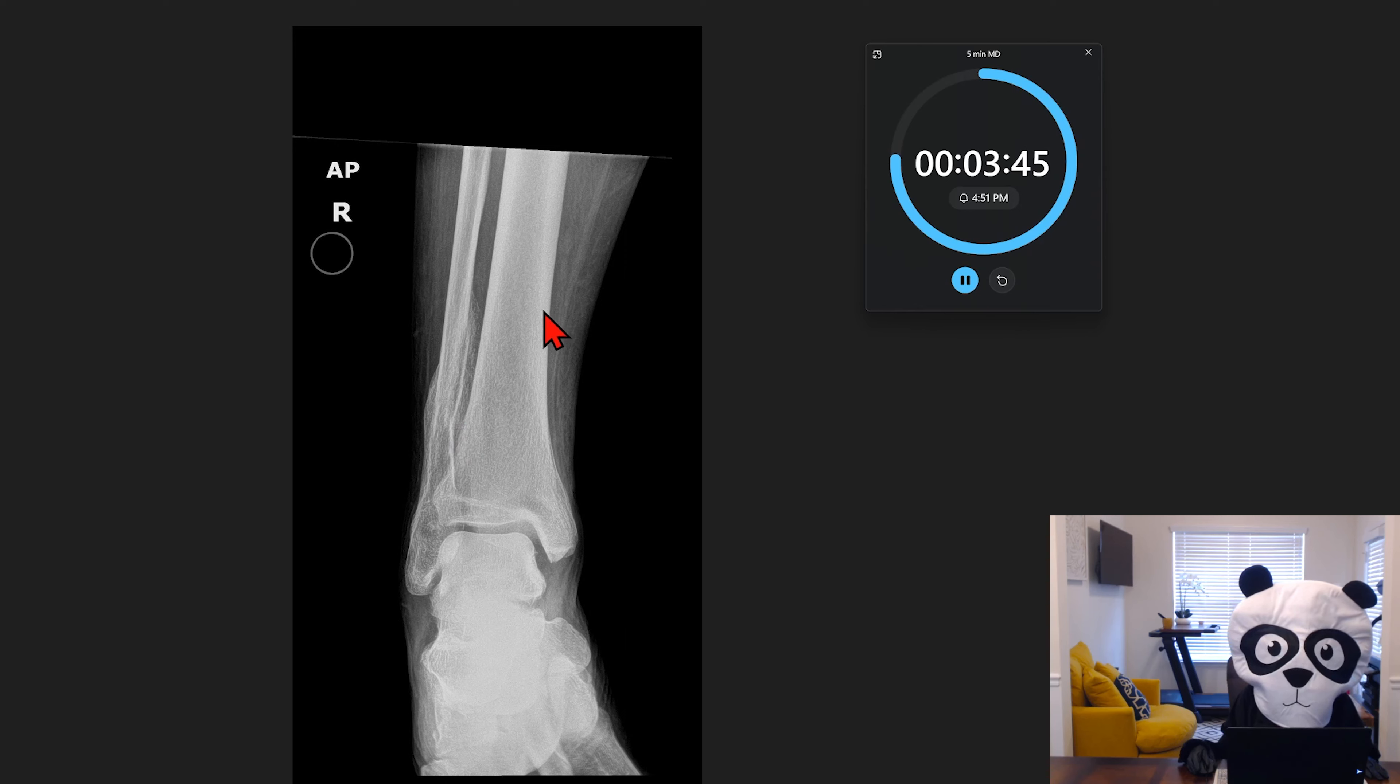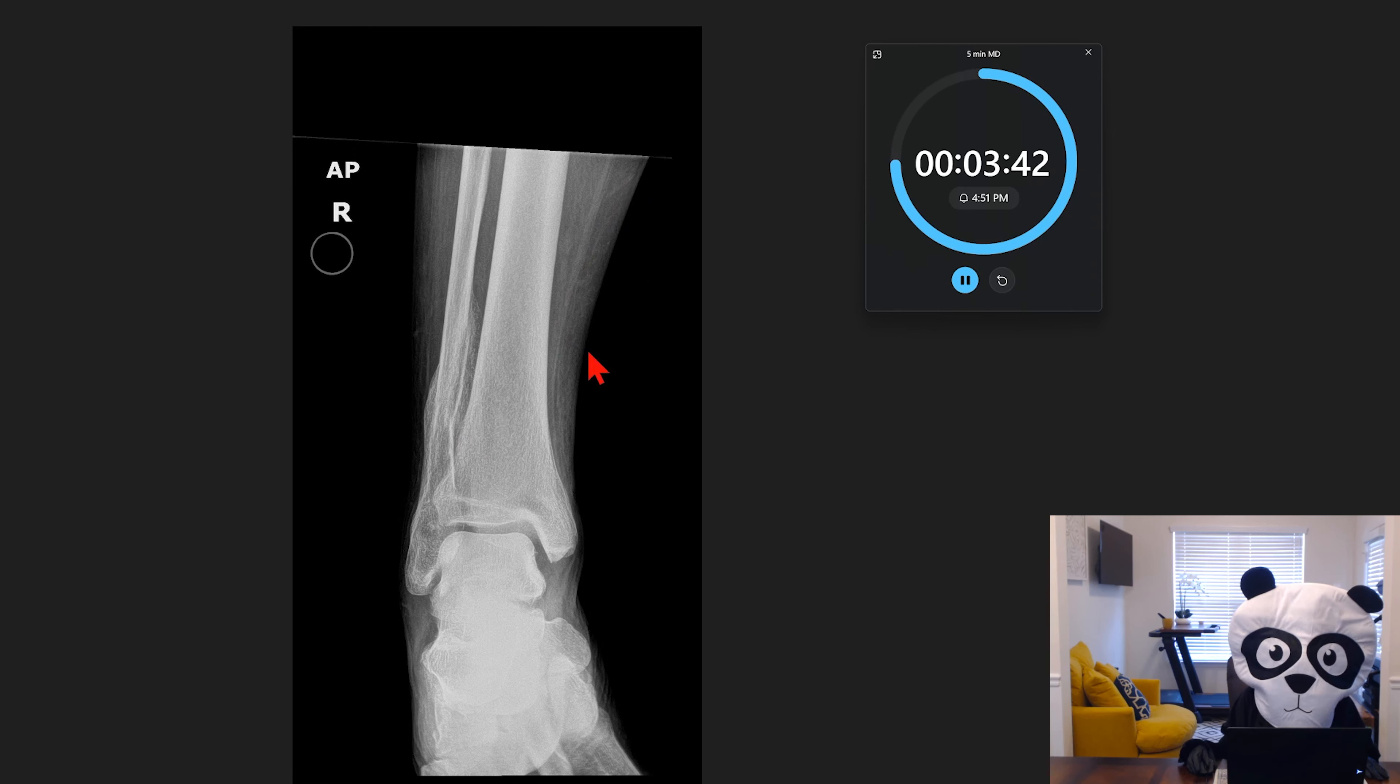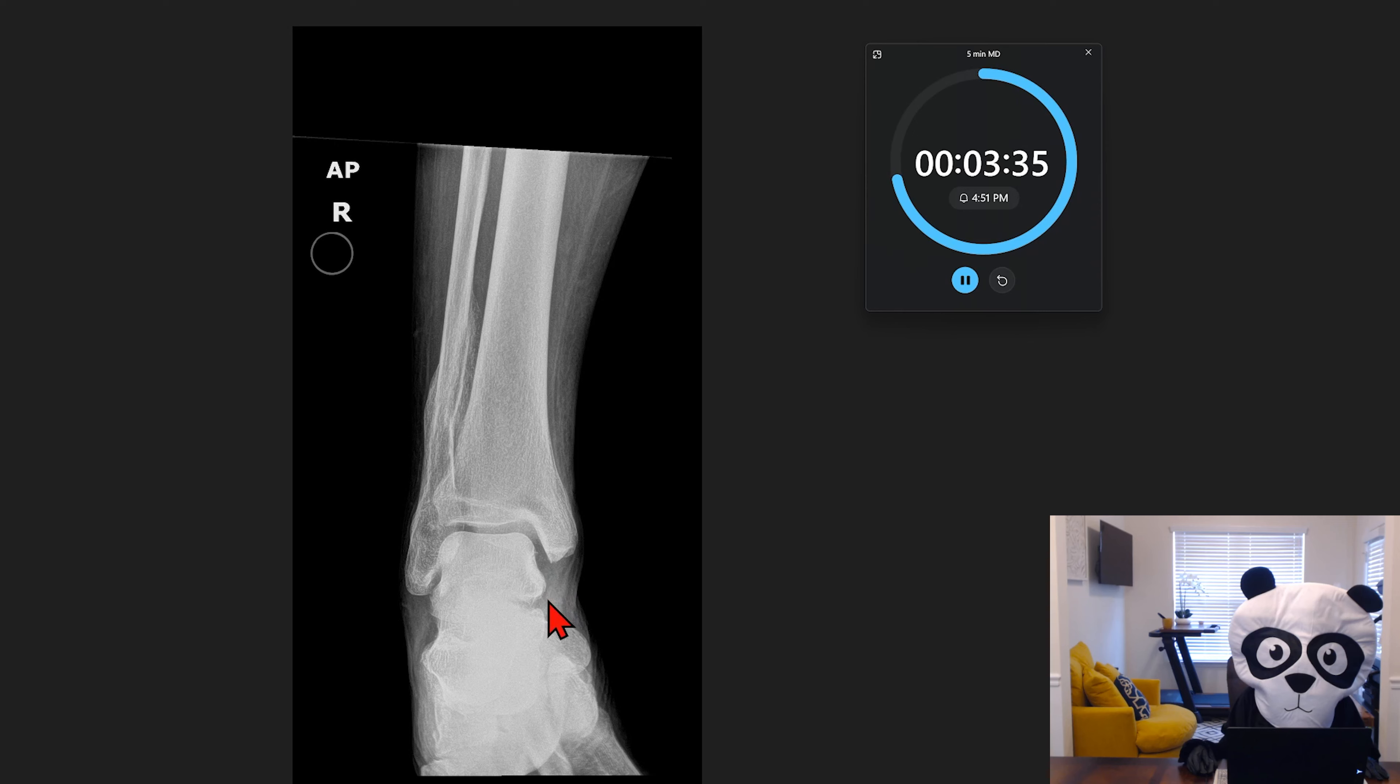Looking at the soft tissues, we can see maybe a little bit of soft tissue swelling here along the lower aspect. And I wouldn't be surprised if there's maybe a small joint effusion there as well.